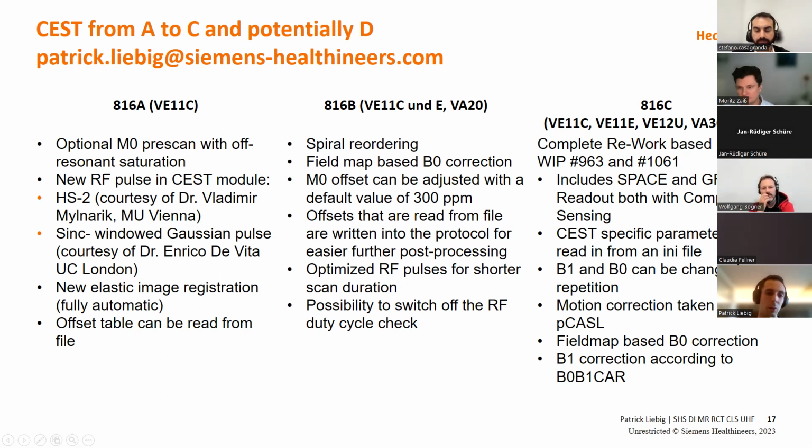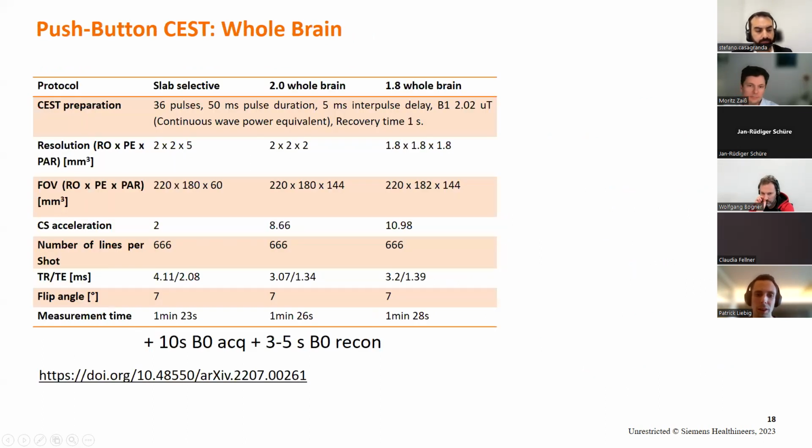In the following, I would just quickly like to go into one feature that is probably the most important one. As Moritz already mentioned, it makes sense to acquire CEST in a snapshot way so that you only have one shot, because it simply saves so much time. And at least as I know clinicians, when you come to them with a 10-minute protocol, or let's say more than a 5-minute protocol, this is really hard to implement in clinical routine. Let's say it's kind of impossible. And I really get their point, so I'm not saying that this is pointless.